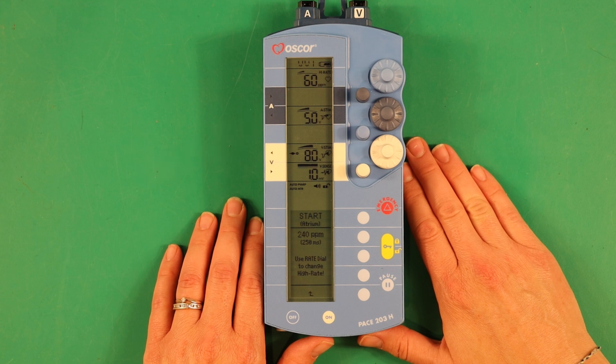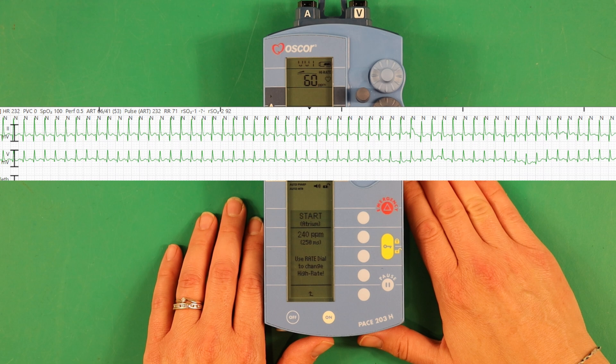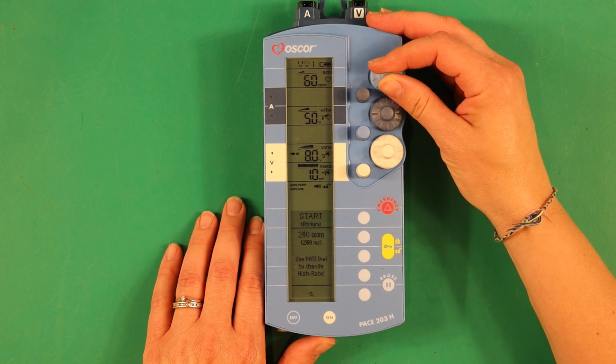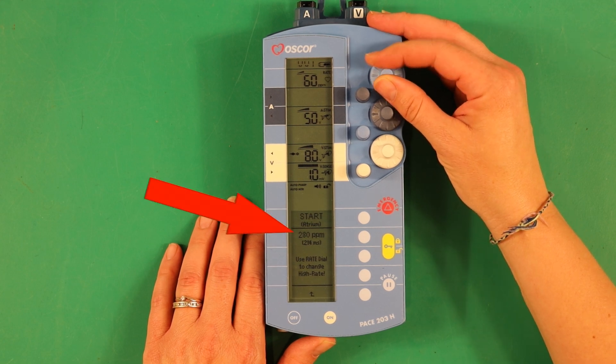Now we need to decide what rate we want to pace at. There is no exact science to picking a rate, but you need to pace faster than the arrhythmia rate by at least 10%. This pacemaker can pace as fast as a thousand beats per minute. Turn the rate dial to set your rate. Notice the number at the top doesn't change. Read the rate down here.